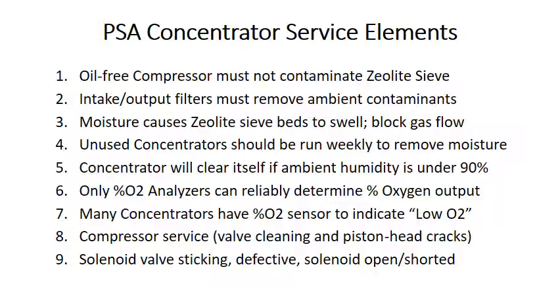Now, one of the things is that only O2 analyzers can reliably determine the percent oxygen output, and that's certainly the primary consideration of measuring whether or not an oxygen concentrator is suited for service. Many concentrators have their own O2 sensor that will indicate low O2 or not ready if they detect that the output oxygen level is too low.